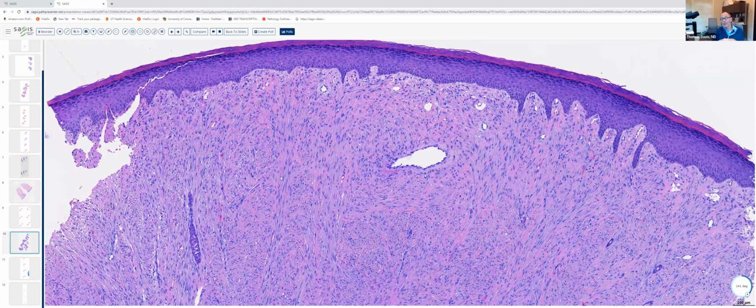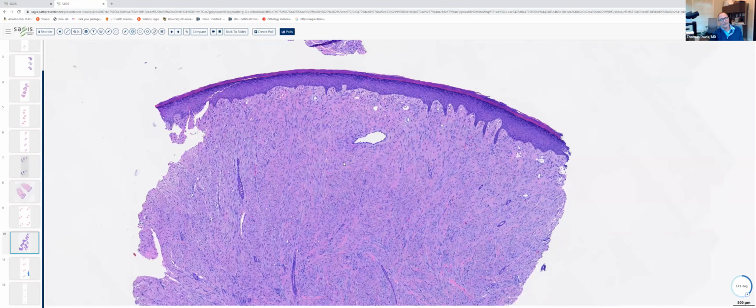But this also goes by the name inclusion body fibromatosis. And if you ever see it on a pick list, what you want to do is go down on high power and look for the inclusions. This is kind of a high power recognition diagnosis, but high yield. So just a beautiful example. We don't see biopsies very often of this condition.